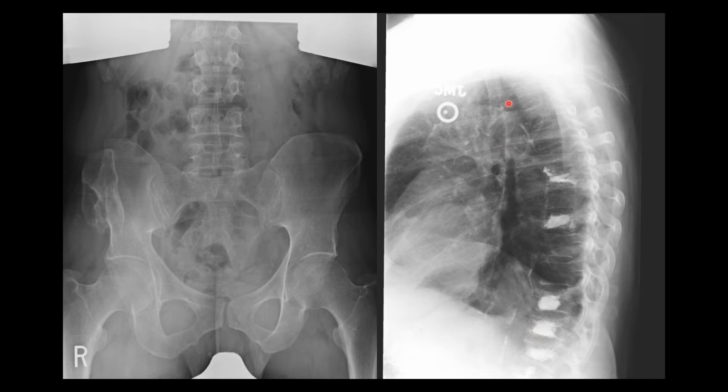Over here on the right side, if we're looking at the bone, we can see that the cortexes look thinned, trabecular patterns aren't quite there, and then we're also noticing these very dense structures within some of the vertebral bodies, and what these are essentially is cement injected within the vertebral body to prevent it from collapsing. So this person had some compression fractures within their spine, and these were to help prevent them from getting any more severe.